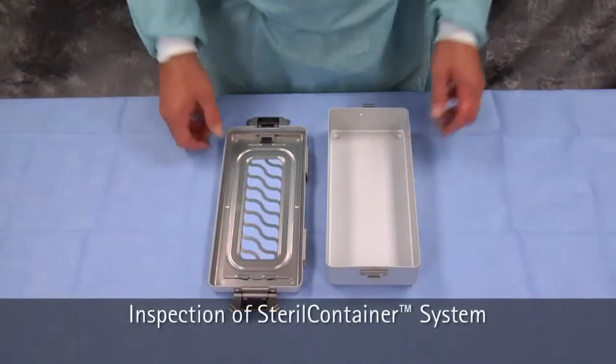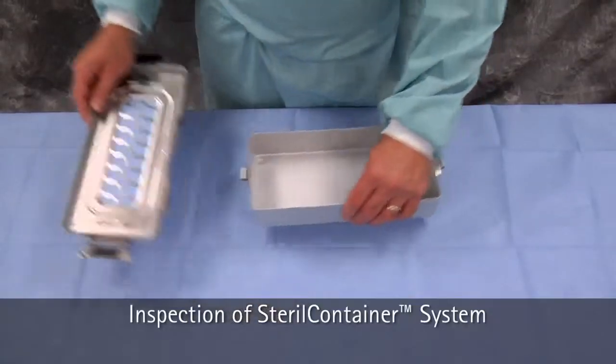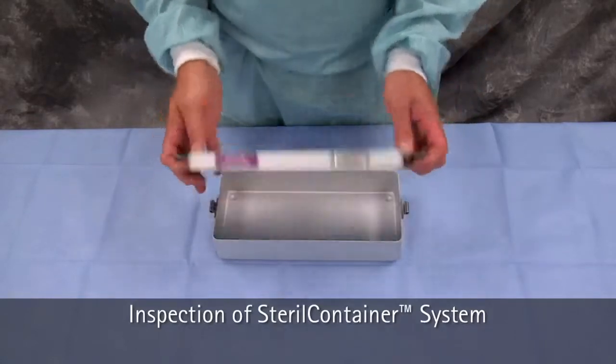First, inspect the container bottom and lid to ensure the two pieces align properly. Inspect the gasket to ensure it is not cracked or damaged.